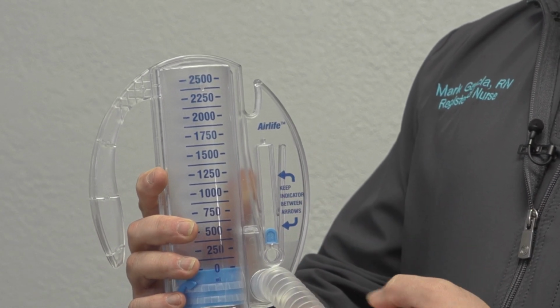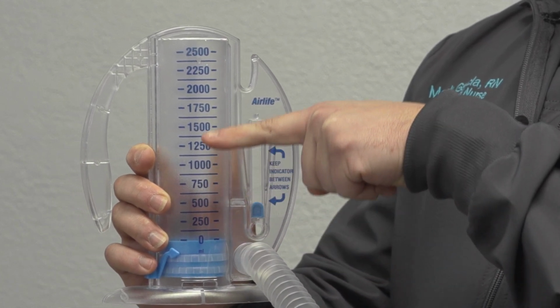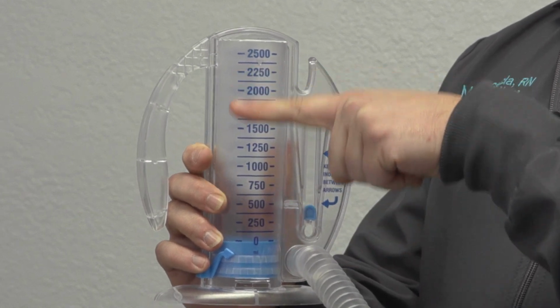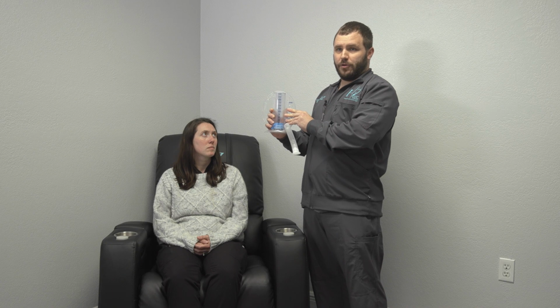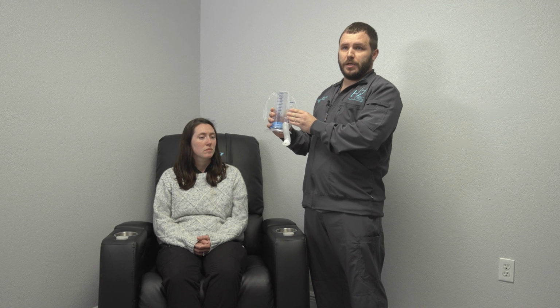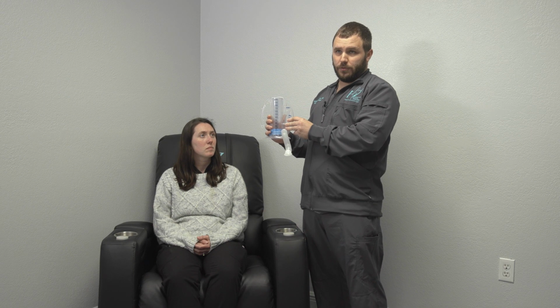As they're taking in that nice, deep, steady breath, this blue bar will rise up, up, up, and the goal is to get it as high as the patient can with each try. Eventually, the goal is to be able to get it all the way to the top. Patients want to do this about 10 times every hour, or if they're watching TV, every time there's a commercial, do it 5 or 6 times. This helps facilitate deep breathing to expand the lungs, get lots of air in there, and it helps prevent things like pneumonia after surgery.